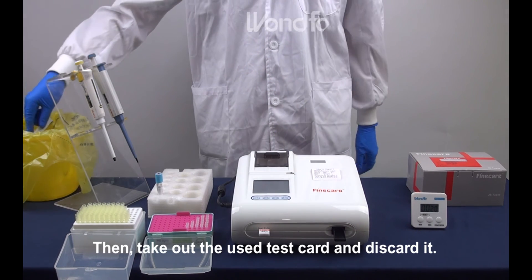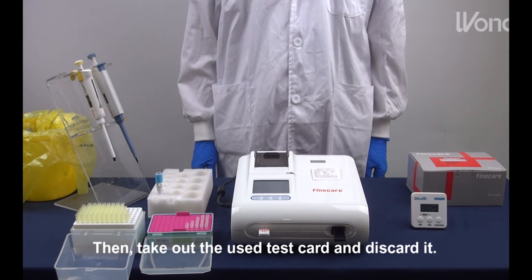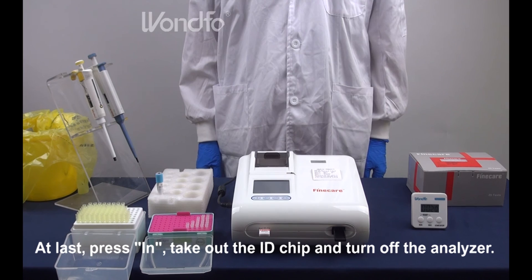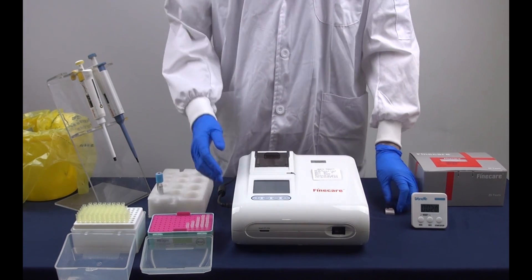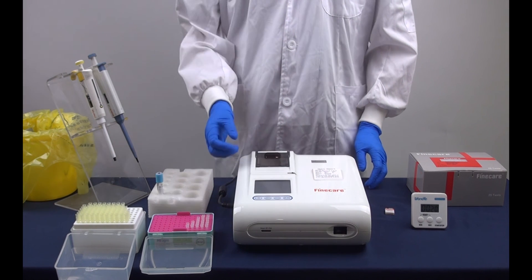Then, take out the used test card and discard it. At last, press in, take out the ID chip and turn off the analyzer.